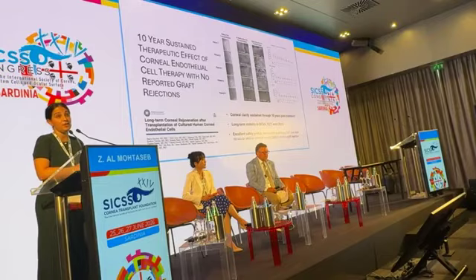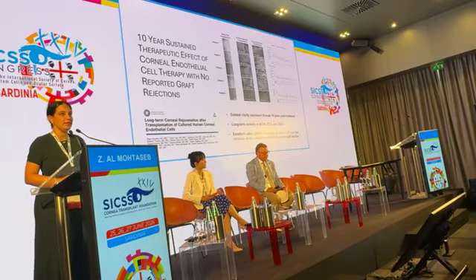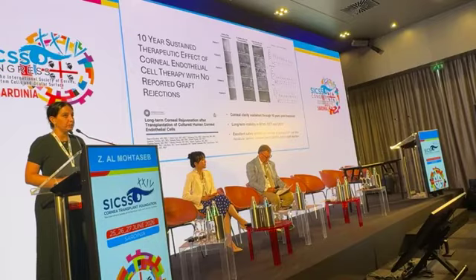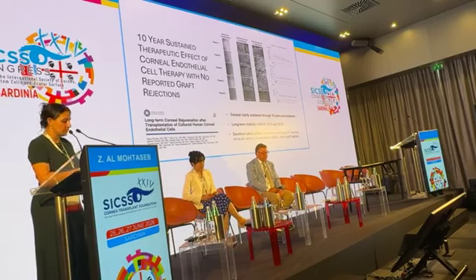What we're seeing, even at 1 year in our data, is really the lasting endothelial cells. Number 2, when we talk about the guttae, if you look at the endothelial cells, you can see blunting of the guttae that improves over time. So you have that initial mechanical improvement from the polishing, but again, with the regeneration of the monolayer, you see significant improvement.